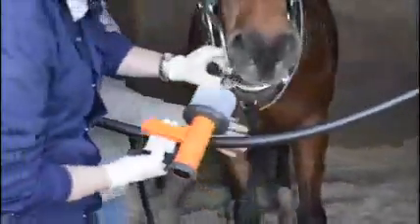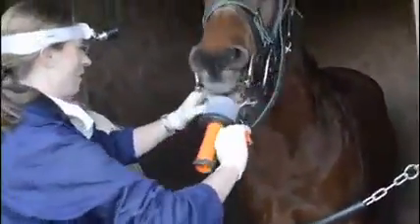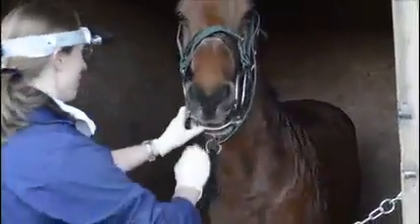And we'll just have a little rinse out with some water. Everything's already been popped out, so we'll just give this a good rinse, if there's any food material. He can get his revenge and spit it all over me.